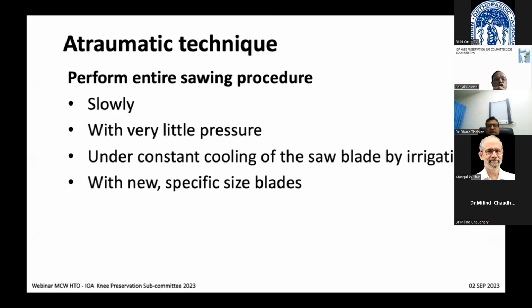The osteotomy should be done by an atraumatic technique. The entire sawing procedure should be done slowly with minimal pressure under constant cooling to avoid thermal necrosis, with new blades, because that also helps to decrease the heat.